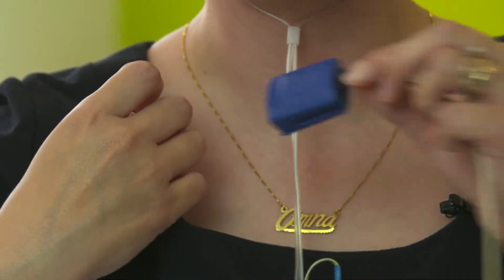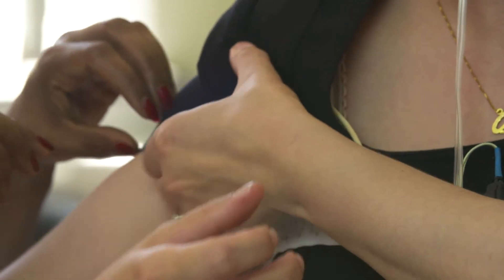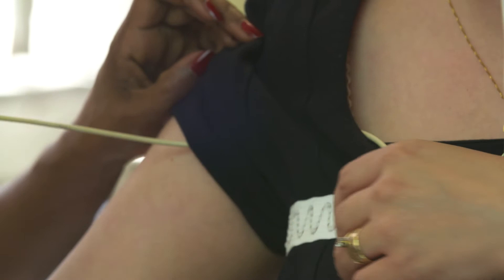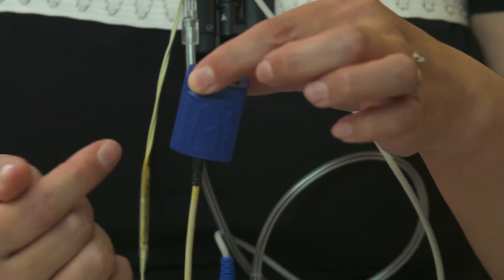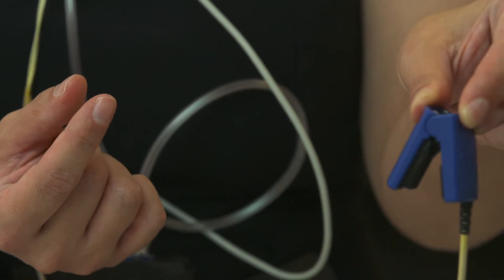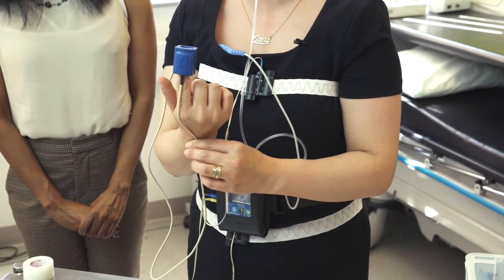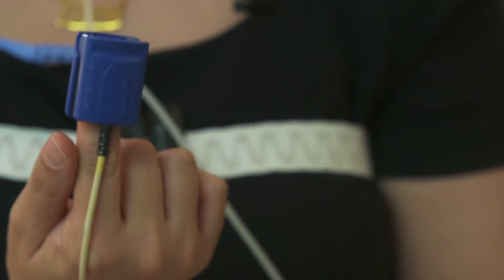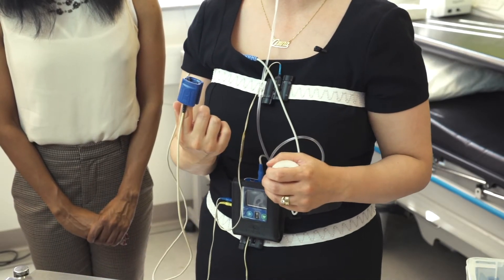The next bit to put on is the finger probe on the end of a very long wire. Feed this through the neck of your clothing, through your sleeve and down your arm. The finger probe then gets attached to your finger. There's a picture of a nail and that's the direction your finger should go into the finger probe — you pinch it, finger goes in and release it. With the wire to the back of your hand, it can go onto any finger, either hand, and you can change fingers during the night if you need to.